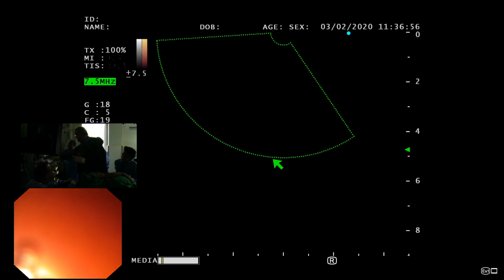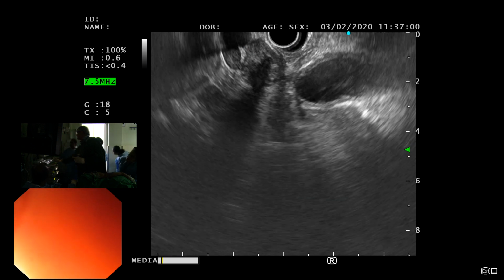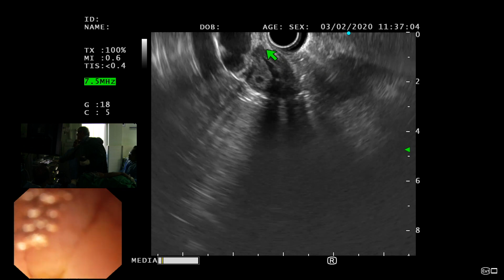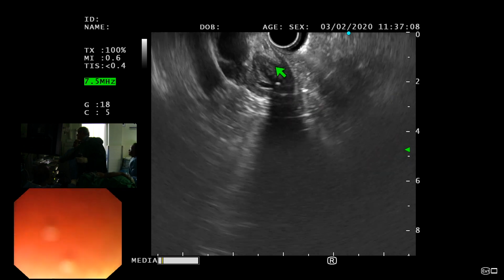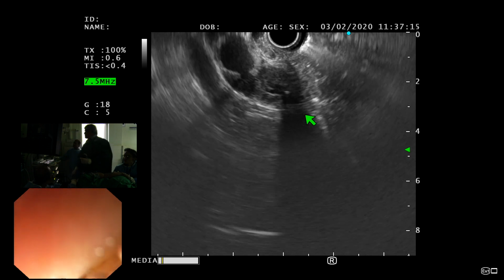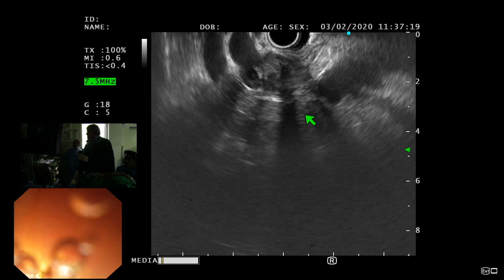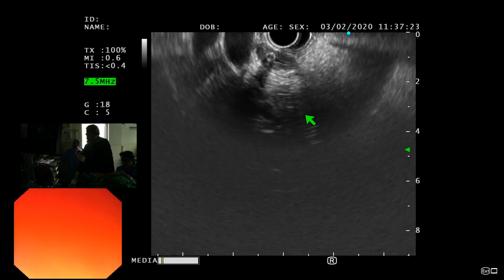This whole thing is the bile duct. Hatao top, Doppler hatao. Just want the cursor here. See, the bile duct is here. That's the bile duct. Sir, can you see that? What are your comments about the CBD wall? That's what I'm saying. You look at this bile duct here. We're just going to try and follow it distally. So to me this is, see that's the bile duct there.